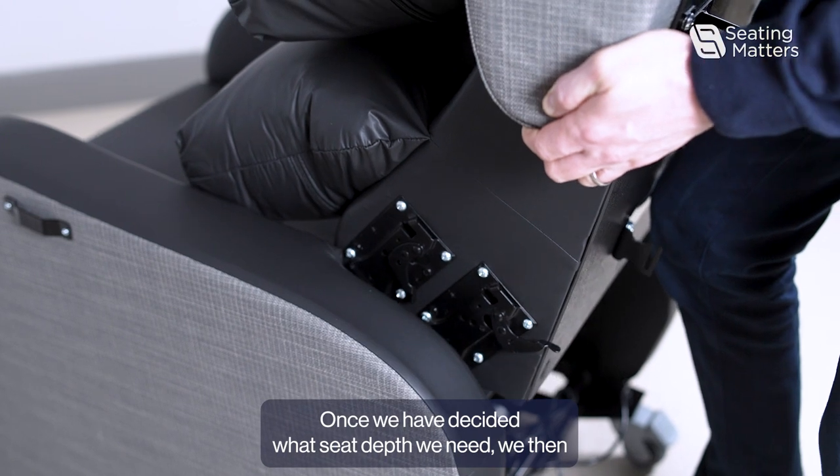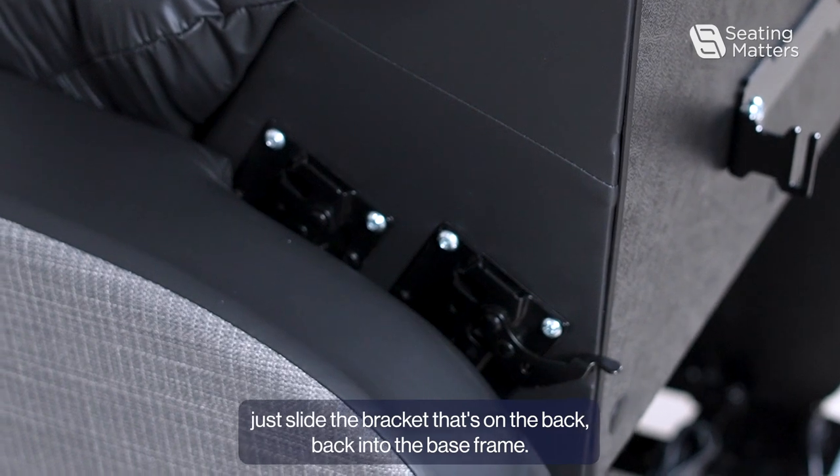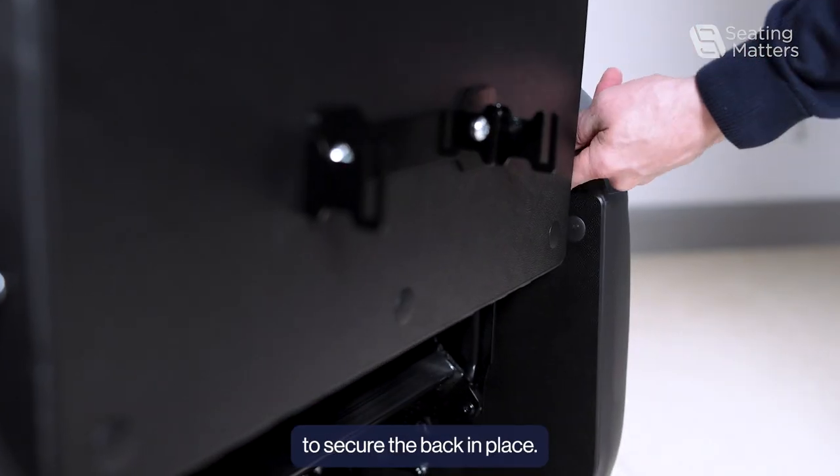Once we have decided what seat depth we need, we then just slide the bracket that's on the back back into the base frame. We must make sure that the clips are pushed in fully to secure the back in place.